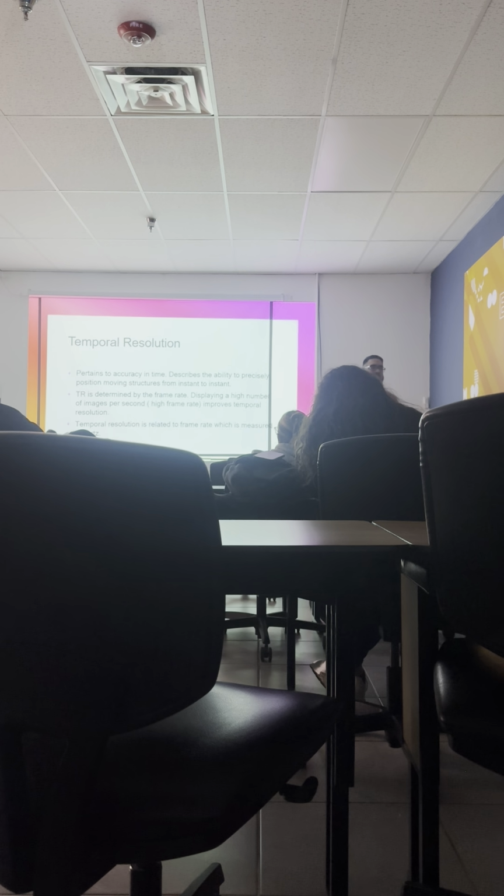And what does hertz mean? Frequency. Per second, yes, per second. So how many frames per second? Which one has a higher resolution, 10 hertz or 5 hertz? 10 hertz, right? Because the higher the frame rate, the higher the temporal resolution. Everybody understand that? Yes?